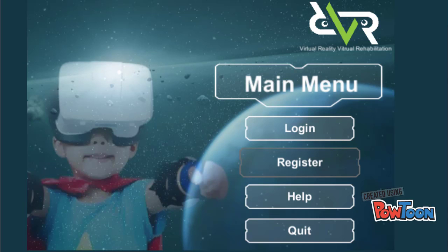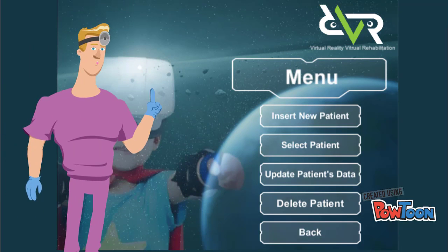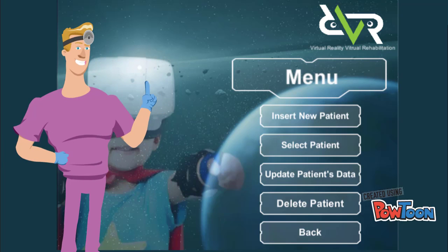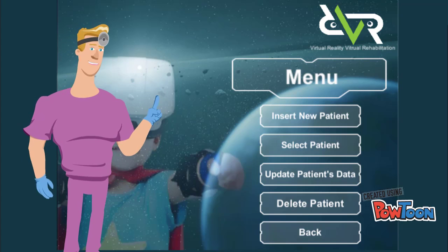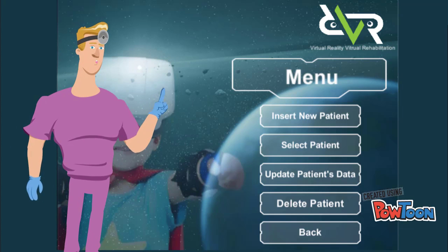The user interface login system is for the therapists. Each one has a unique account to access the data of his patients. Using the patient's user interface menu, the therapist can admit new patients or retrieve their data if already existing. They can also update their previous data, or even delete the whole registration.